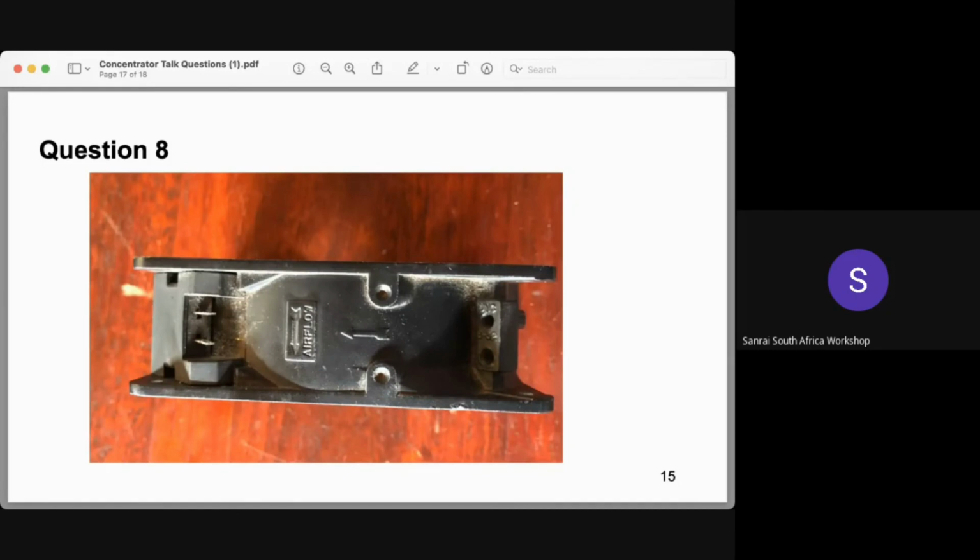If you look at the image on screen, it is the airflow. The diagram, the image on screen, shows the airflow direction arrow and the blade rotation direction arrows on a 120 millimeter AC cooling fan. The way the fan is placed varies in different concentrator brands. For the DeVilbiss brand, the fan is placed in such a way that it sucks hot air from the concentrator to the external surrounding. When the orientation is reversed, it blows in air from the external surrounding into the concentrator, and this slows down the air circulation, which leads to overheating after a particular period of time.